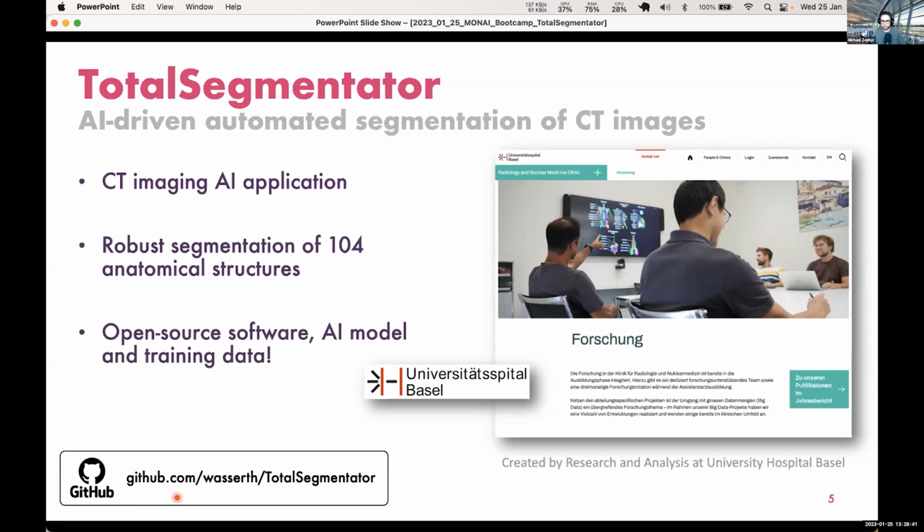One more in here, but do you get approval per hospital for AIDE, or can you run it at any hospital in the trust? So again, that will depend on UKCA marking. At the moment, it's going to be per trust, but you'll be able to install it on AIDE, and then if those trusts opt into using, then all of the technology will be in place for those hospitals to then go ahead and start using their products, or those apps rather.